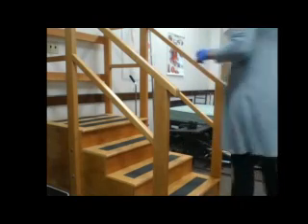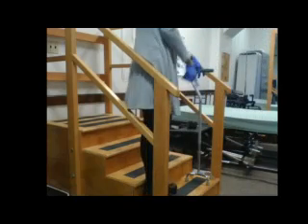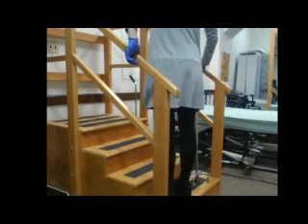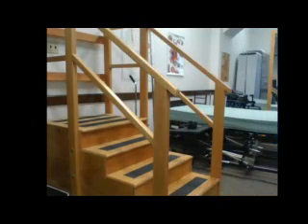So, with the quad cane, with a narrow base quad cane, it fits on the stairs, so that's perfectly fine to use it that way. With a wide base quad cane, it won't fit on the stairs, but it is okay to turn it to the side to use it. Okay? All right, with crutches.